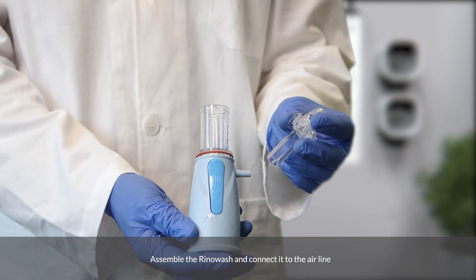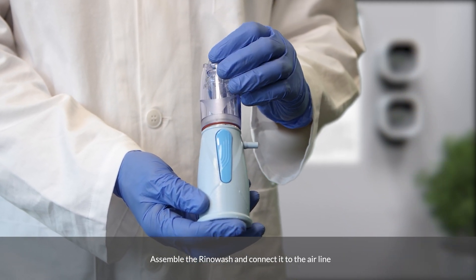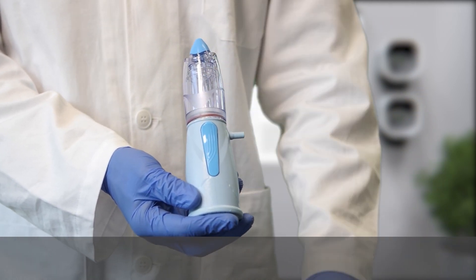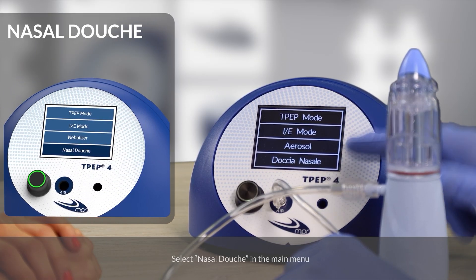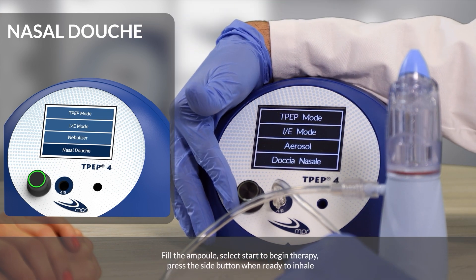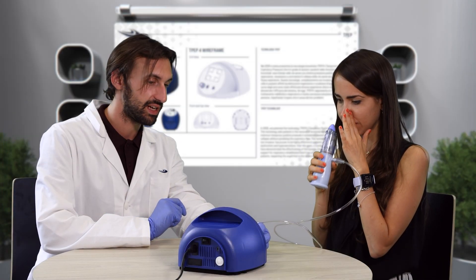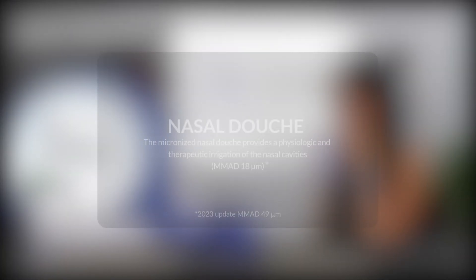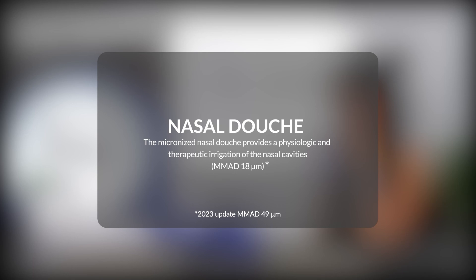Nasal Douche. Assemble the Rhino Wash and connect it to the airline. Select Nasal Douche in the main menu. Fill the ampoule and select Start to begin therapy. Press the side button when ready to inhale. The micronized nasal douche provides a physiologic and therapeutic irrigation of the nasal cavities. MMAD: 18 microns.